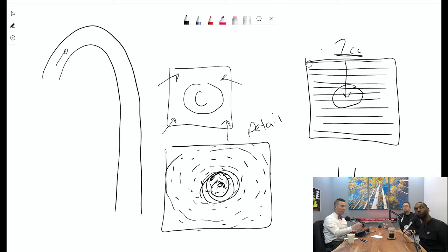If I'm waiting for it to be bright here, that's going to give me a lot of trouble, because I've already filled the center of K space really quickly, so this is going to be dark. So what I would like to do, if I'm doing 2 cc's a second, is maybe do 1.5 cc's a second so that it lasts. I've wondered that before, why don't we decrease the injection rate to open the window of opportunity? In this case, that would make total sense.